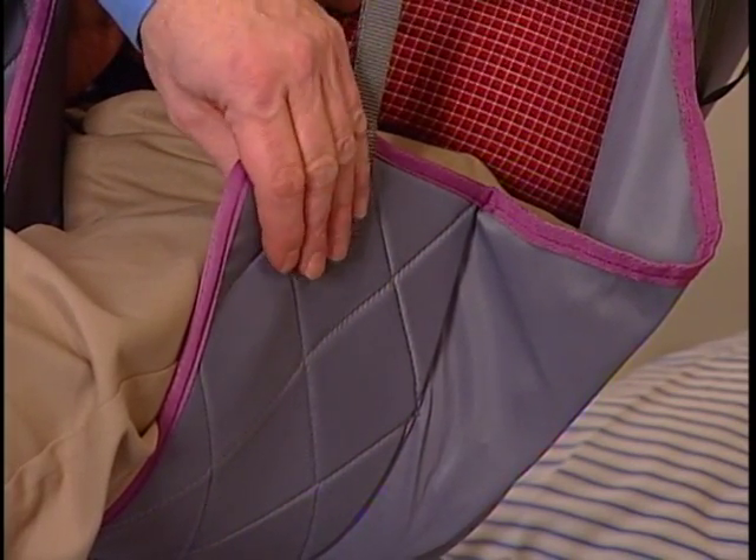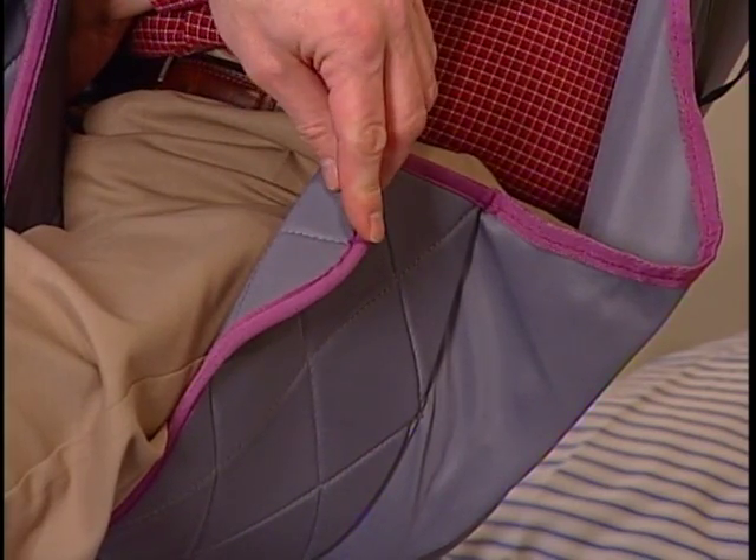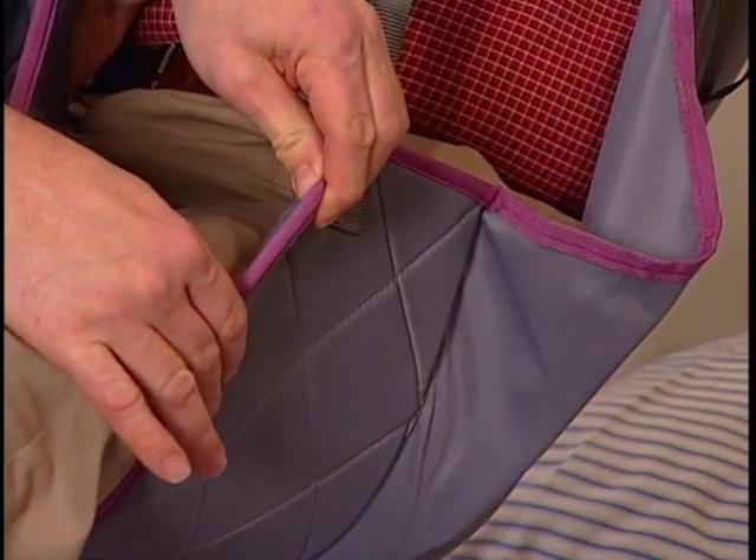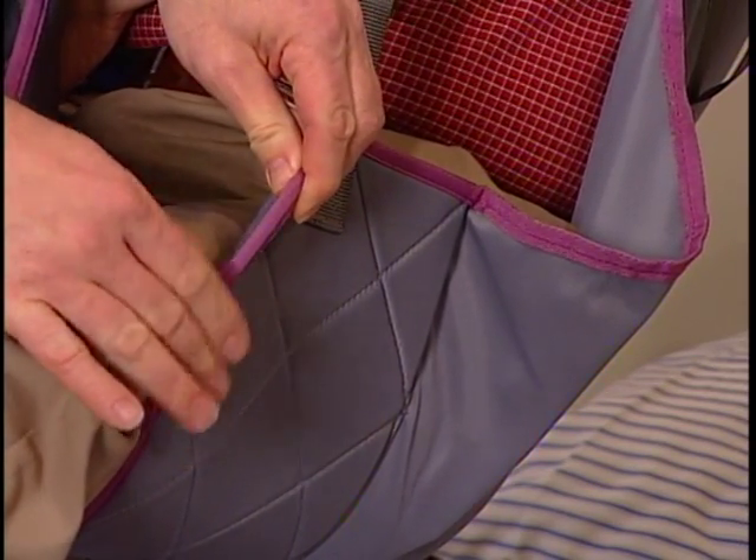The soft lining helps prevent sliding for comfort and skin protection, and its stretch resistant character helps them hold their shape for superior comfort and ease of positioning.